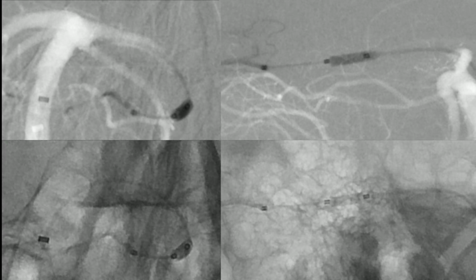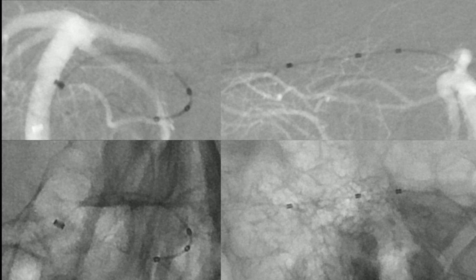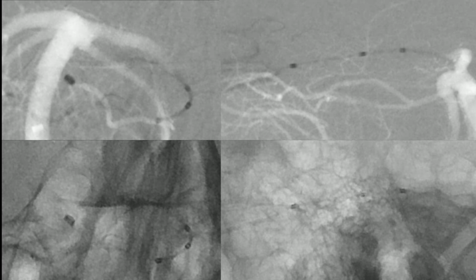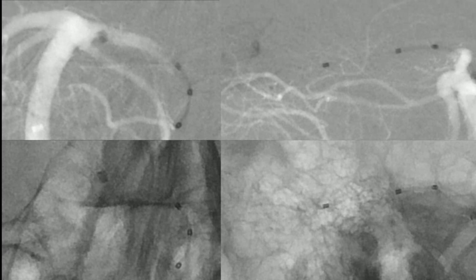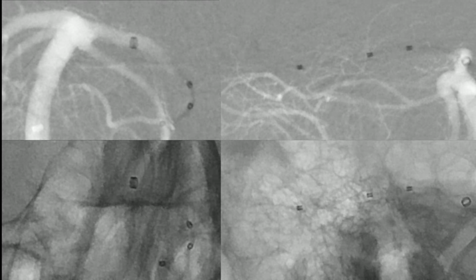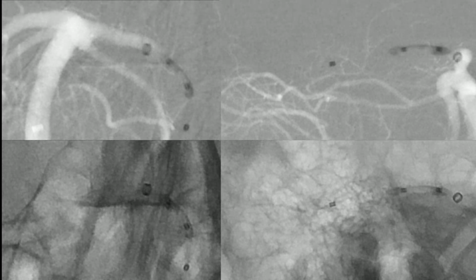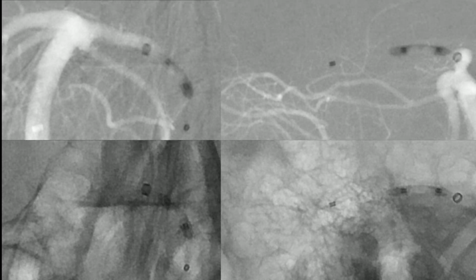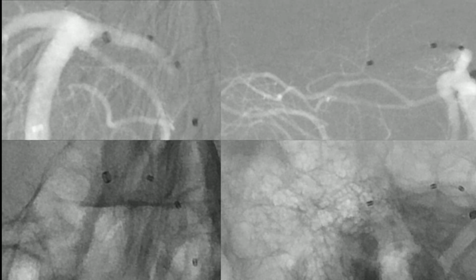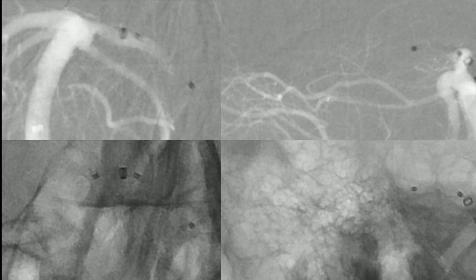It's a long stenosis, that's why we will perform many PTAs overlapped while we retract the balloon. This is the second PTA, and now the third PTA. The balloon slips a little bit, that's why we pull it back and repeat the PTA. There is a little bit of air in the balloon, but this is not a problem as long as it stays in the balloon. And this is the fourth PTA. We go to 6 bar in each PTA.